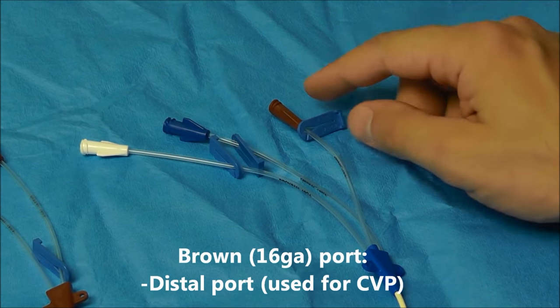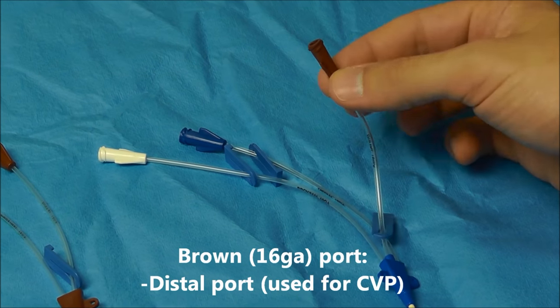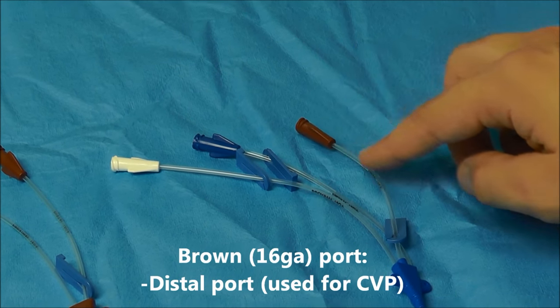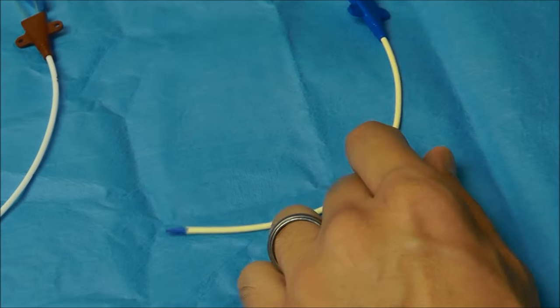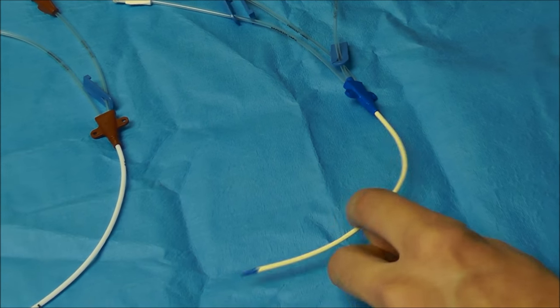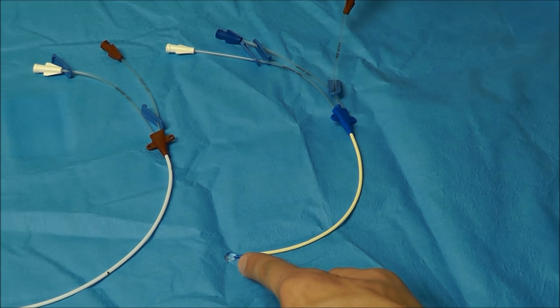The brown port on these catheters is called the distal port because the opening goes all the way to the tip of the distal catheter, and I can demonstrate that right now. If I hook something up to this brown port, you're going to see fluid is going to come out right here out of the distal tip.